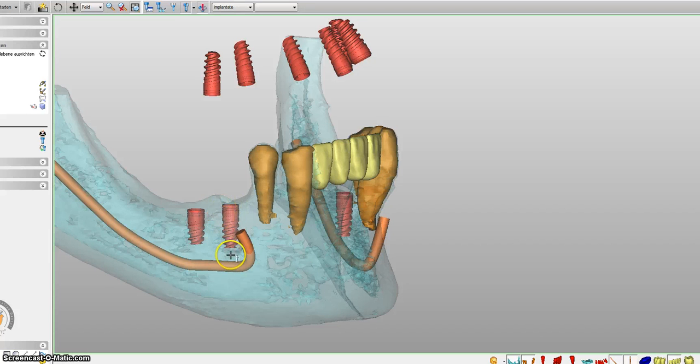It gets completely integrated into your bone. That means that once we place the implant and wait for a couple of months, the bone closes the gap between the implant and the bone itself, and you cannot remove this screw anymore. So it's not like a screw in the wall, which you can put in and take out again. This here gets completely integrated into your bone, and it will not fall out anymore, and you cannot unscrew it.